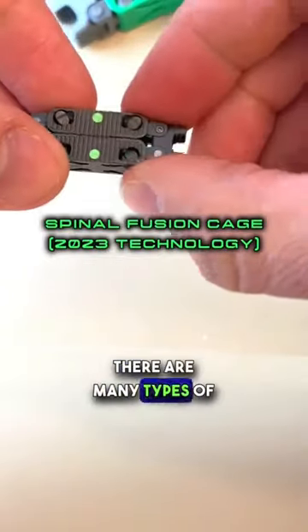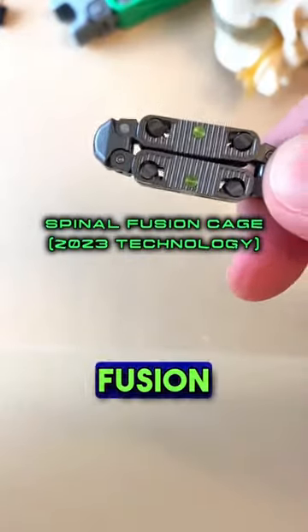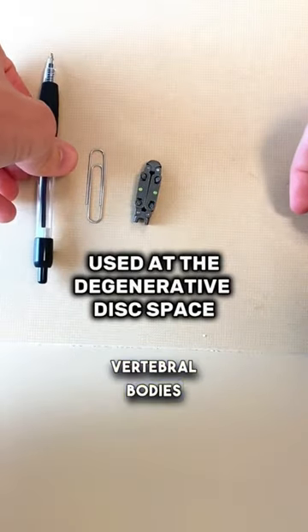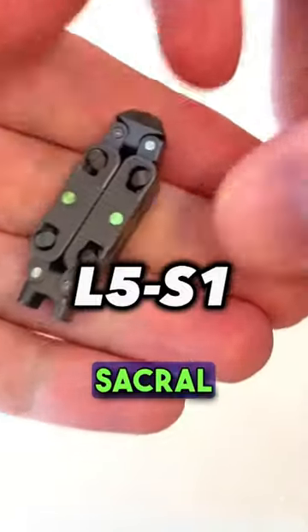In spine surgery, there are many types of cages that are inserted into the spine to help achieve a fusion. These typically go at the degenerative disc spaces between the bones of the vertebral bodies, most commonly at lumbar 4, lumbar 5, and lumbar 5, sacral 1.